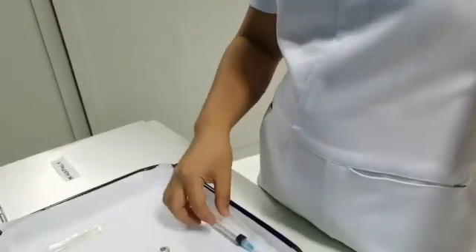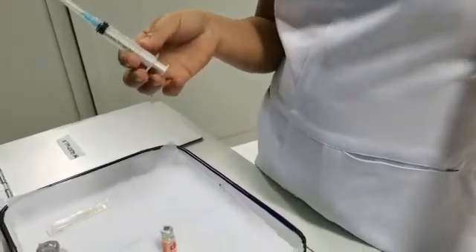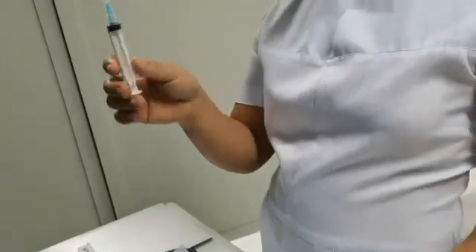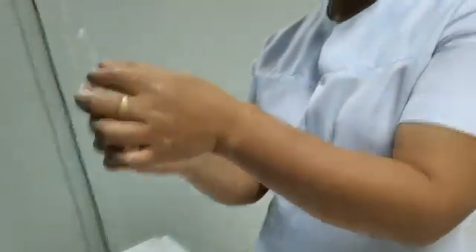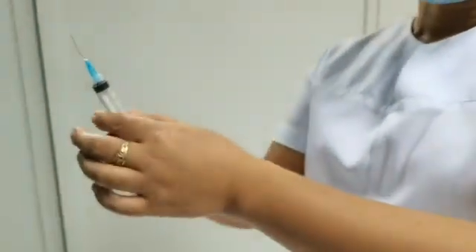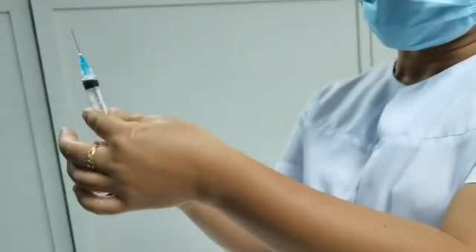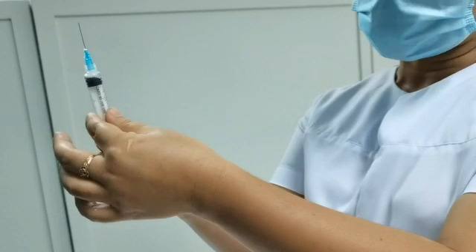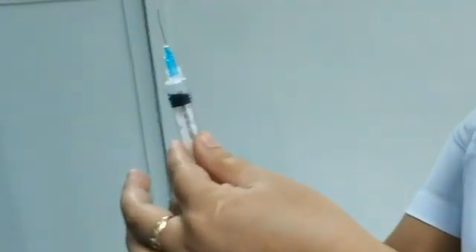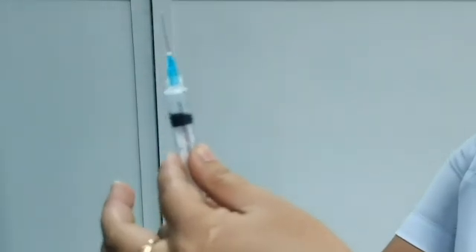After diluting the medication inside the vial, it is time for you to withdraw the medication. So in withdrawing the medication, you just open the cover of your needle syringe, and then withdraw or move the plunger down the exact amount that you are going to get from the medication vial.